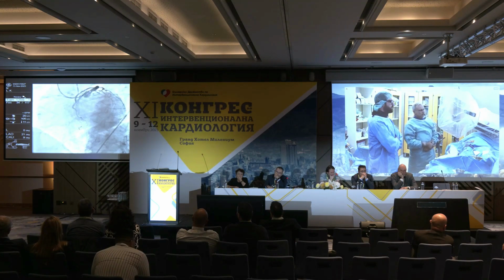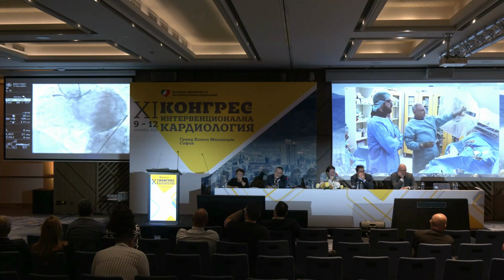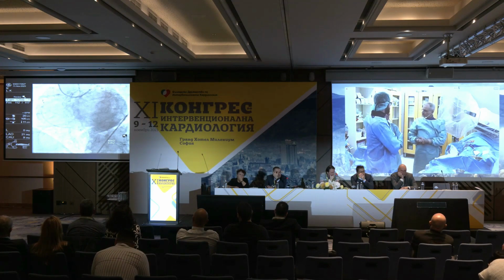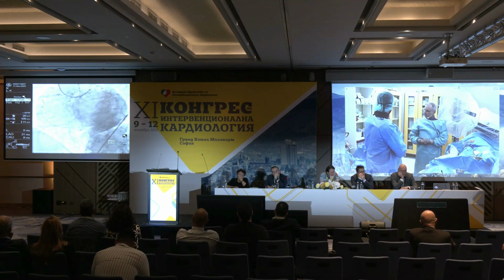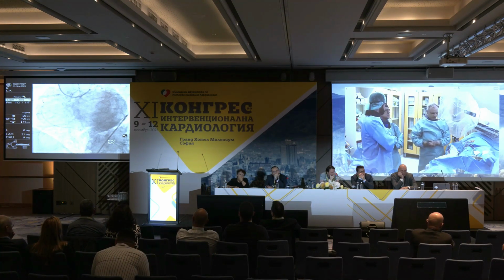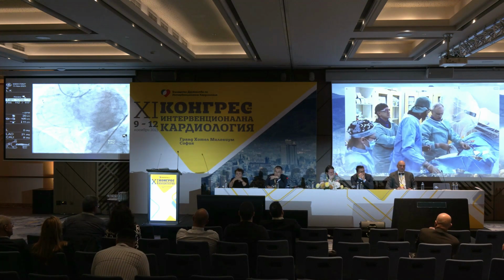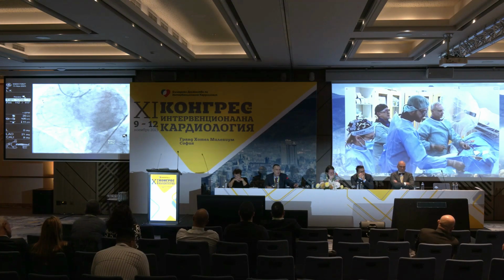Gelef, why don't you comment about what you were saying a little bit in this projection? If you see deeper here, let me just go a little bit back. You see that retrogradely, there is one channel that goes up, and that was my feeling, but I think it's a branch. Because it is going beyond the proximal part. I mean, it is more proximal than the proximal part of the vessel.